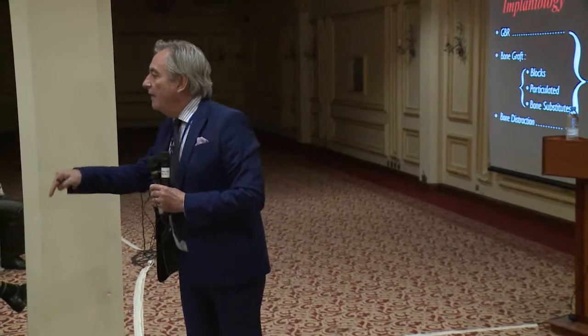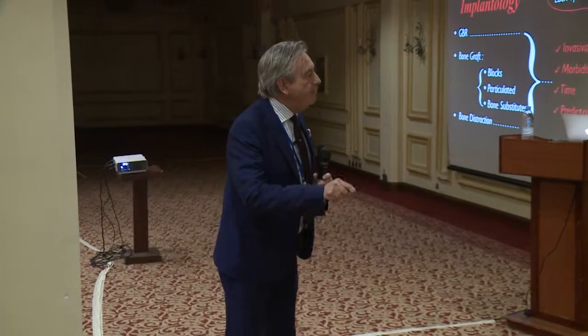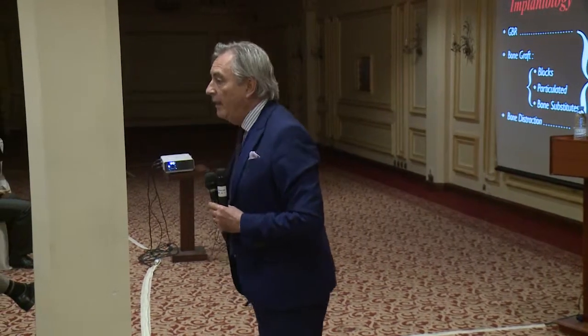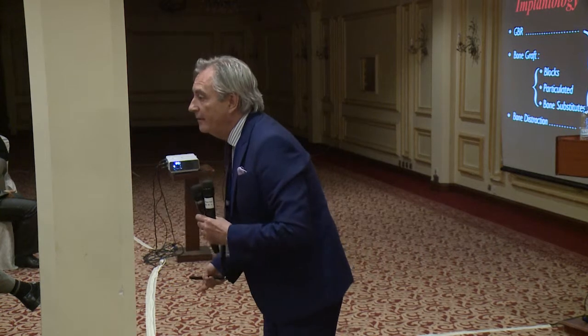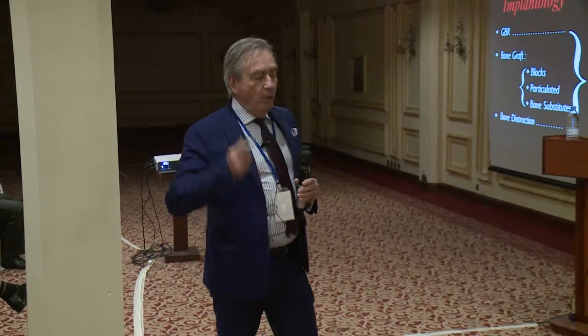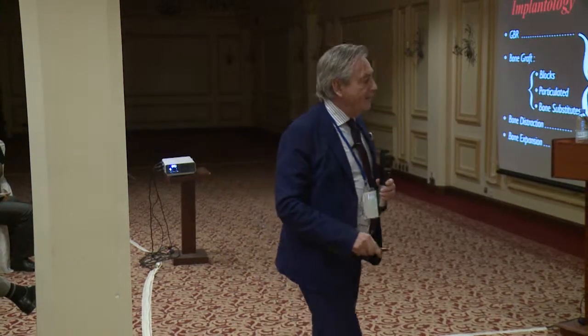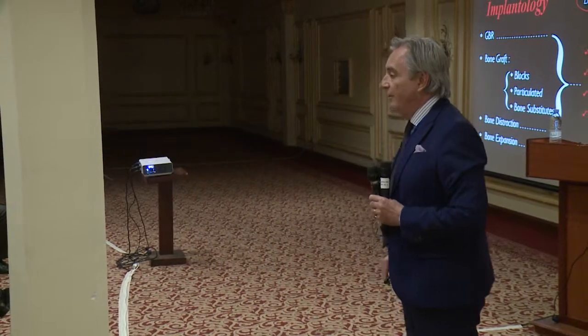How can you say here that the GBR, GTR technique is predictable? Nobody, because it's not. So maybe we have to shift again. And what about bone expansion, bone spreading, bone condensing?